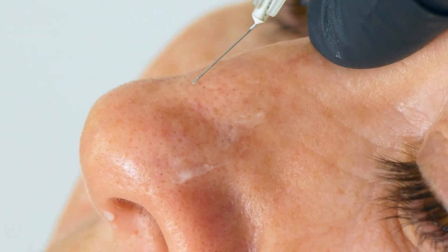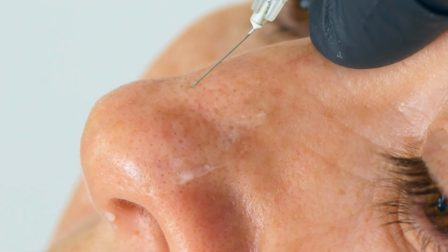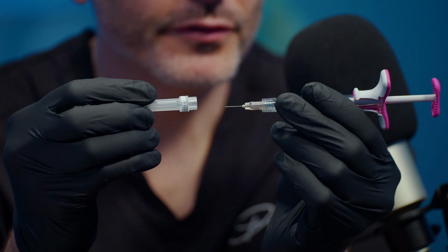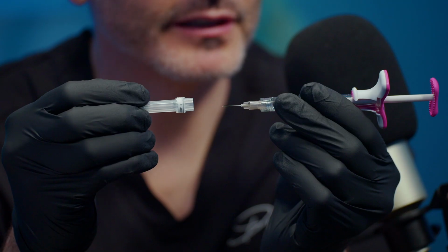First example, an area that I like to bend the needle frequently in is when treating the distal aspect of the nose. This is particularly when I am treating sometimes that little V shape that you get, or trying to make the tip of the nose a little bit sharper. So first step is to make sure the bevel is facing the right direction.